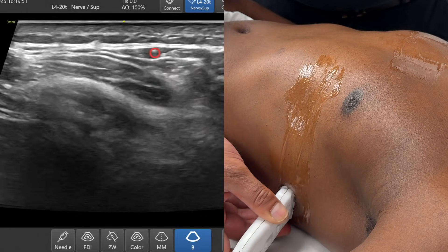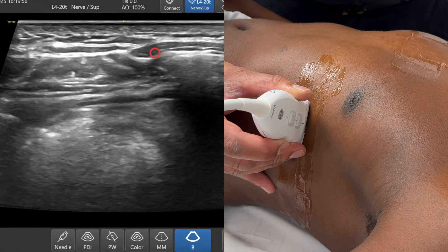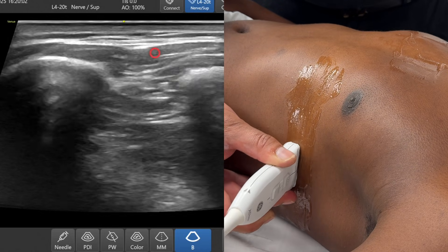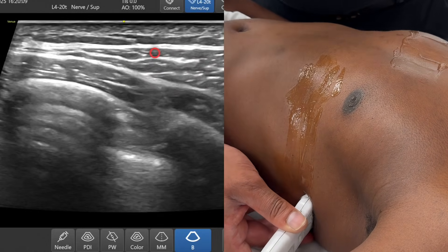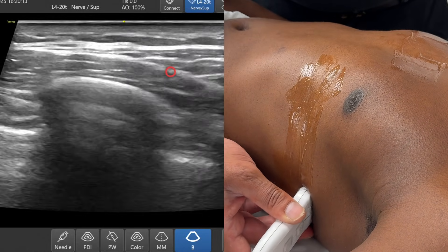As I go up and down, coming anteriorly you can just see serratus anterior, and even more anteriorly, one of the anterior slivers of serratus anterior just disappearing. As I go further back, it's the one muscle that hugs those ribs really nicely. Sliding further back towards the bed and moving up and down, you start to see latissimus dorsi coming into view.